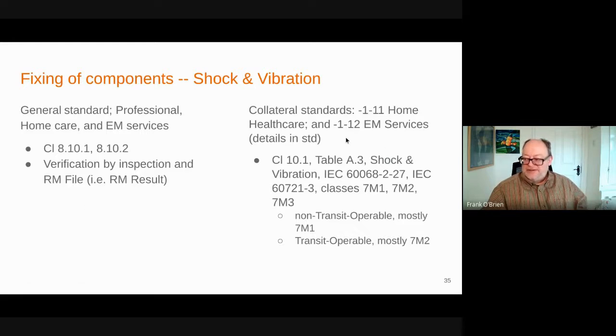Now in the home care and the 1-12 emergency medical services, there's actually a formal shock and vibration test. So I want to make you aware of that. If you think about all the monitor standards, the pulse ox and the ECG, there's actually a formal shock and vibration test in there, and they're the same as the home care ones. And they come out of an IEC 68, and this 60721 defines classes of abuse, if you will. And then the 68 2-27 has tests for each of these classifications.